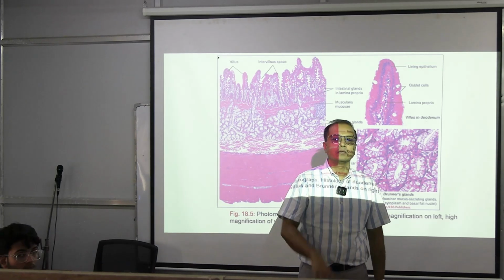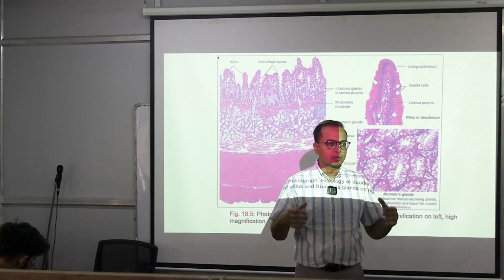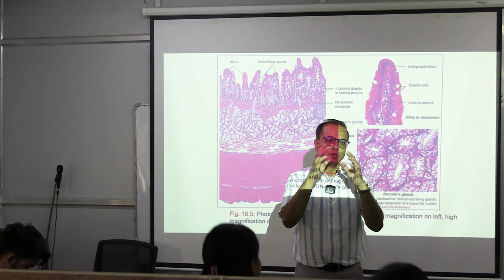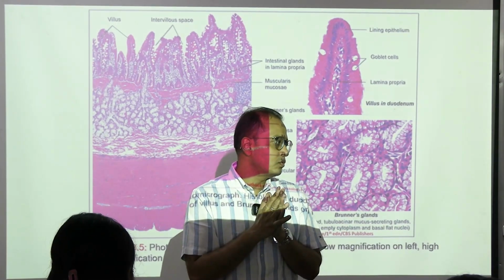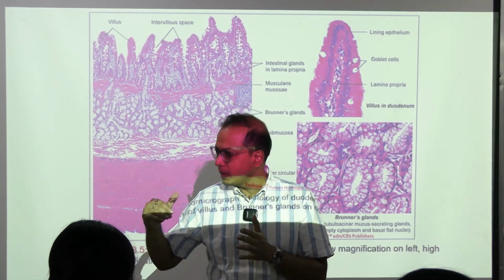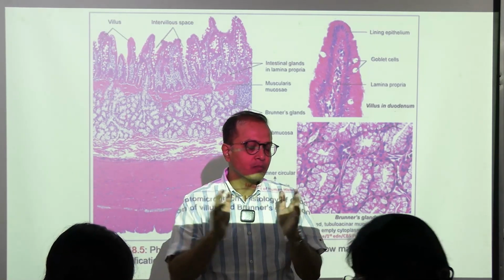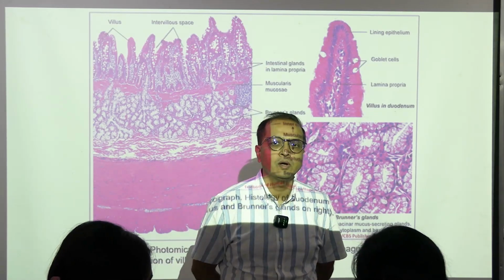There are 3 specimens placed in 3 different microscopes. Try to go through them, and whenever you do, be systematic about what you are looking at and what you should be looking for: lumens and then layers, and which layers or sublayers you are going to explore. If you can separate out between the layers whether it belongs to these subdomains or not, fine; if not, do not bother. If you can remember it as finger-like projections with villi, we are good, we are very good with your identifying.